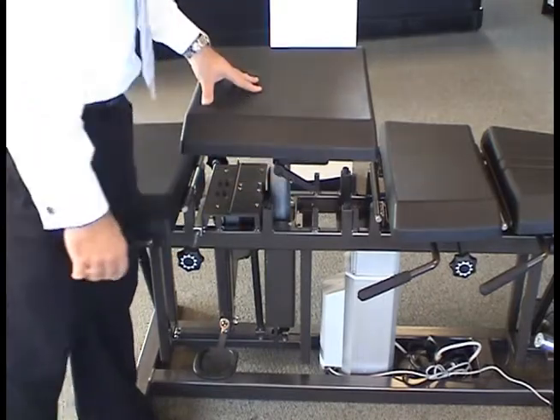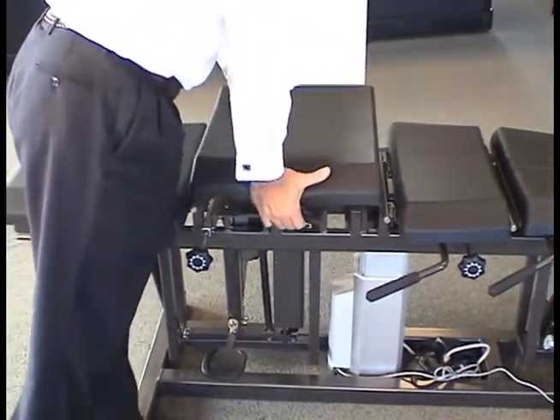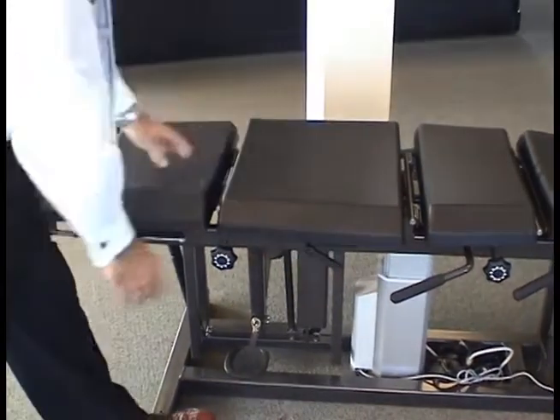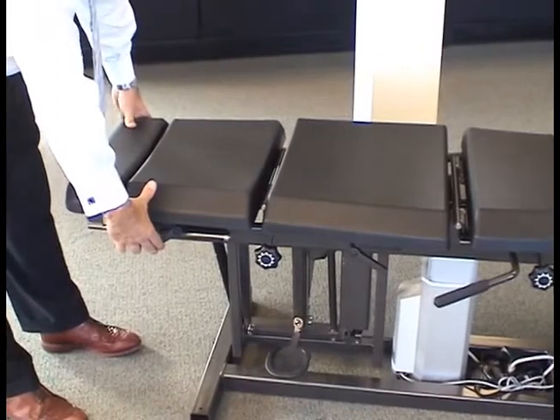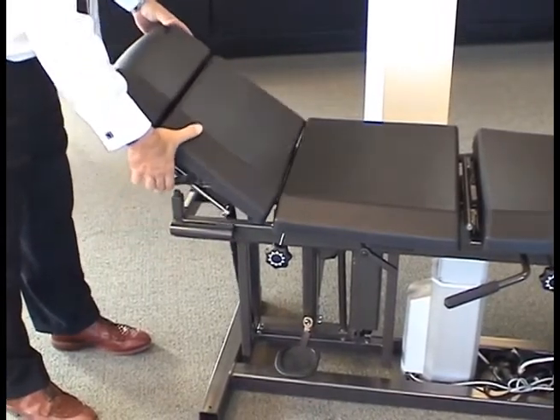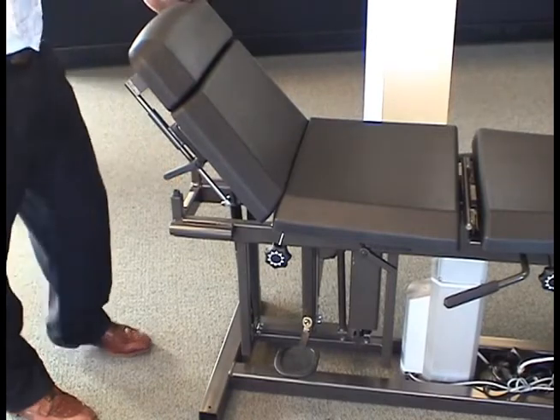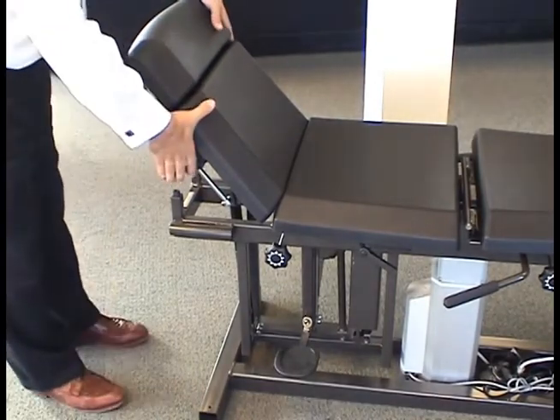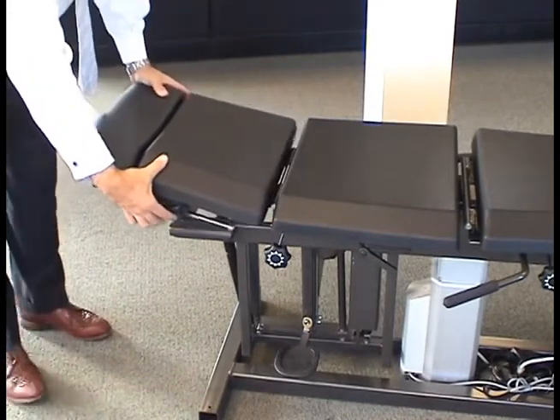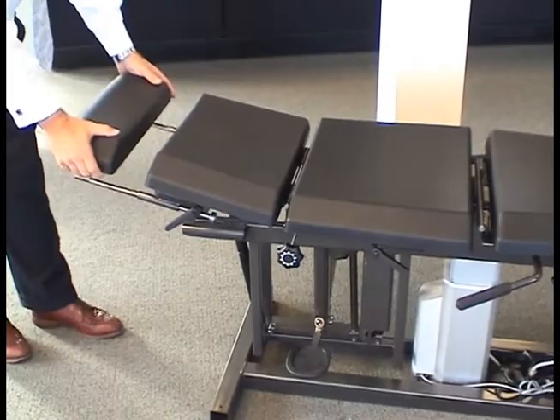Using the leg and foot pieces. The leg and foot pieces are mounted on a single plate and can be raised to an angle of approximately 60 degrees by releasing the black plastic cylinder release lever. The foot piece can be extended 6½ inches on telescoping rods to accommodate different height patients.